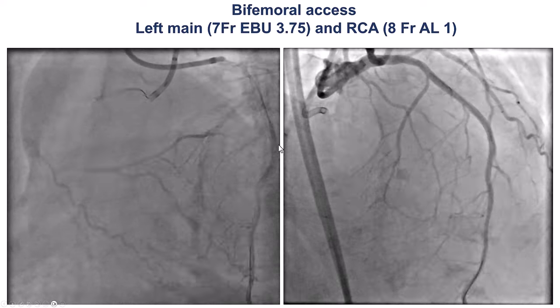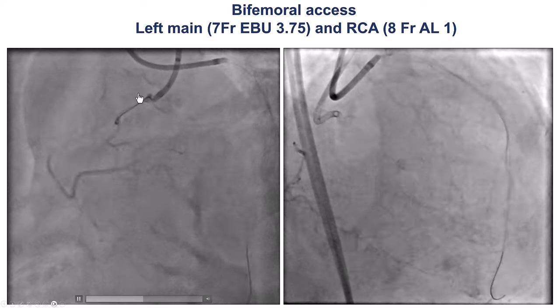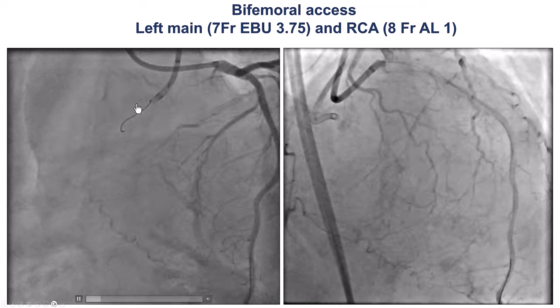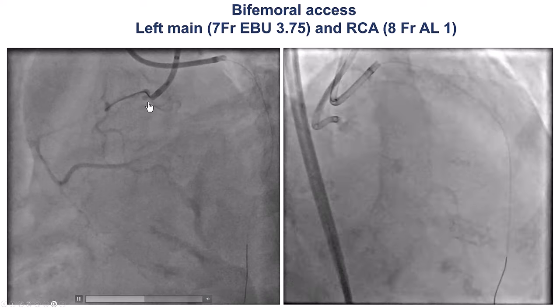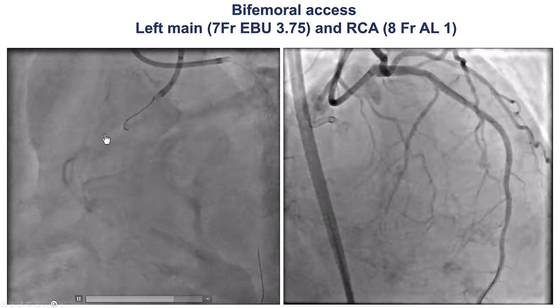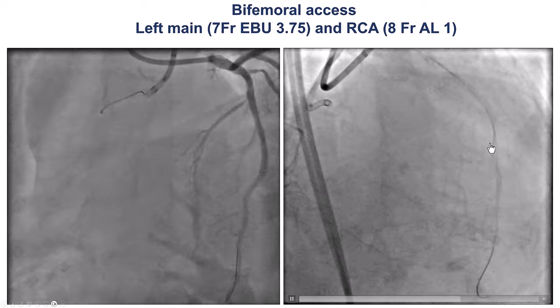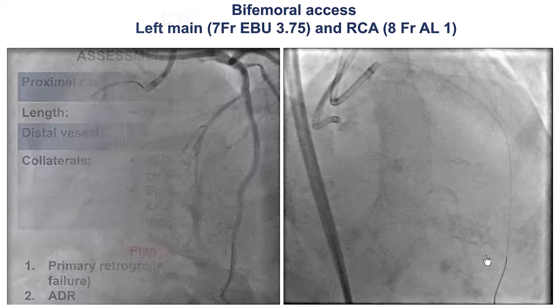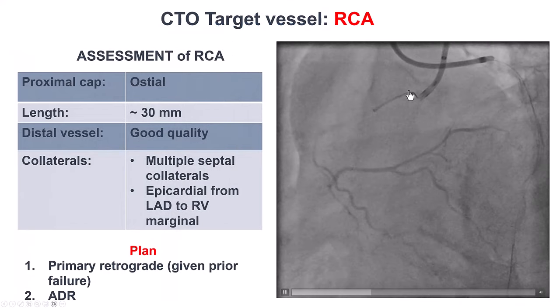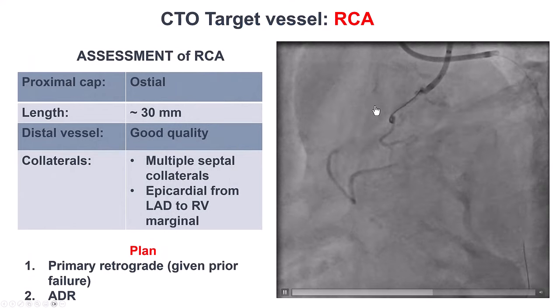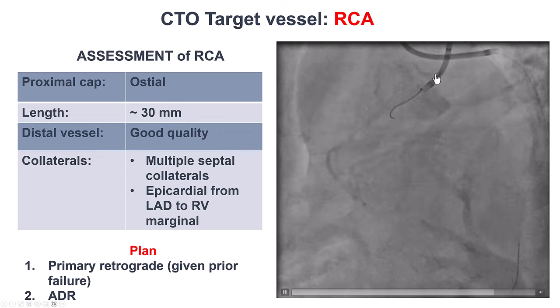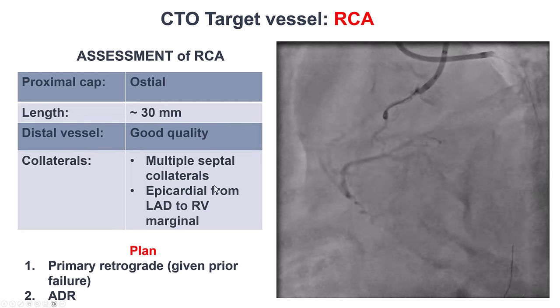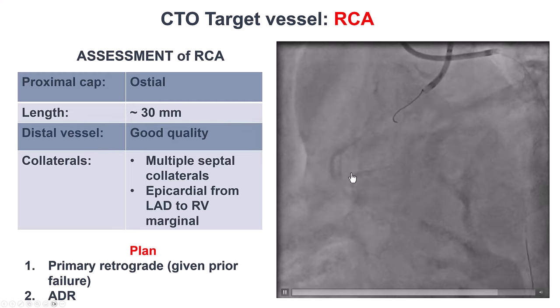This is the coronary angiogram. There is an occlusion at the ostium of the right coronary artery. There is a small nub, a small segment of the vessel, and a conus branch that is patent. We have retrograde filling through septal collaterals from the LAD. This is an osteal occlusion with an occlusion length of about 30 millimeters. The distal vessel, the distal RCA, seems to be of good quality and is filling through septal collaterals.